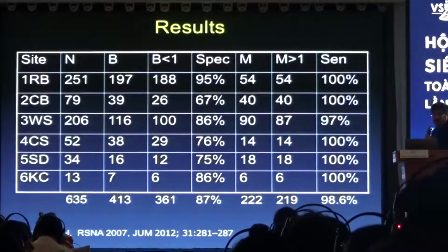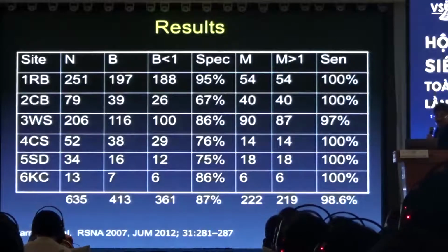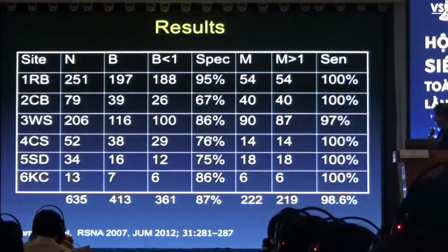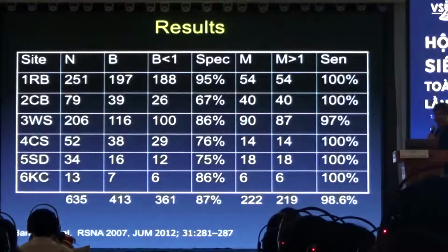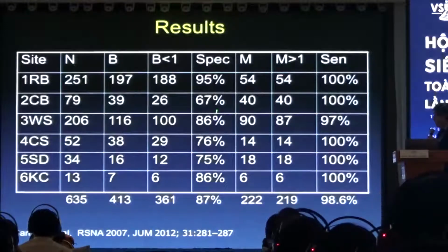And we learned a little bit of information from this, because these 3 cases were cases of DCIS, where you couldn't see the lesion well on B mode, so we think they measured the lesion wrong. If you look at the specificity, it's much different, kind of a wider spread, but still a very good number of 87%. And we did this study before we really understood about pre-compression that I'm going to talk about shortly, and I think that was part of the problem with this, is that people didn't realize how to do a much better job. But you can see we're very happy with these numbers.